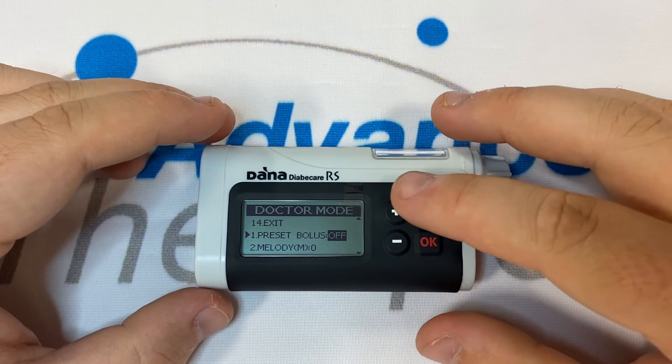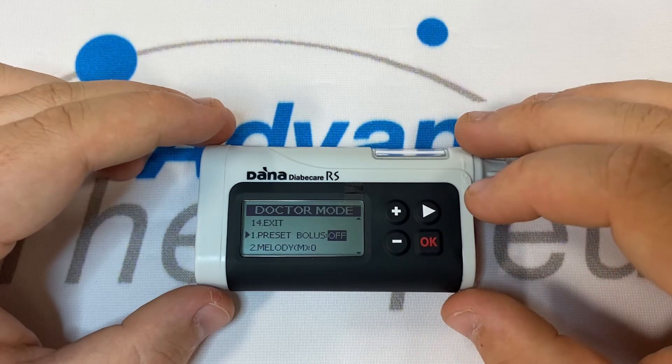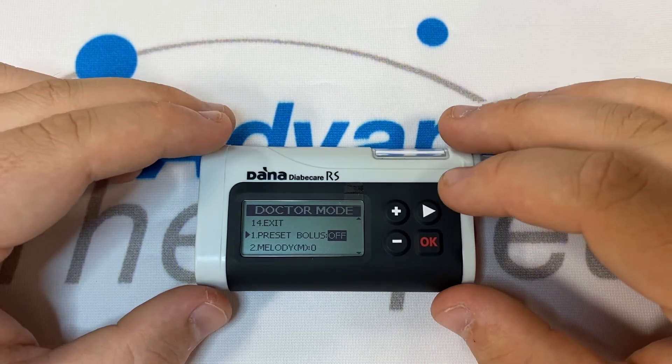Right will move us down the list, and plus and minus will act as our edit buttons. OK only needs to be pressed when we hit the option that reads Exit, and that will save our settings.